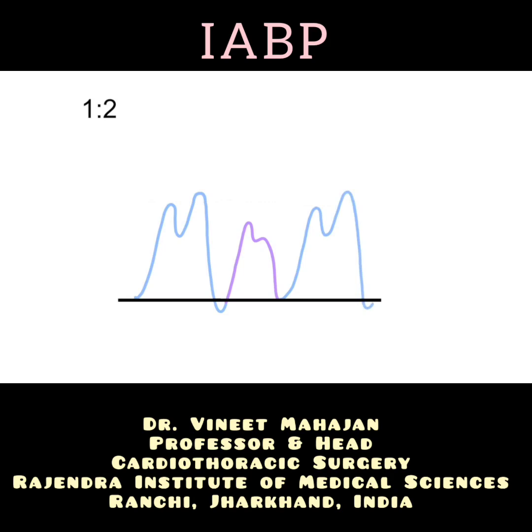Let's analyze. Here we have systole that has not been assisted by the balloon pump. We call this the unassisted systole. With balloon pump inflation, we now see the augmented diastolic pressure because the balloon inflation has augmented the pressure back toward the coronary arteries. As the balloon deflates, the pressure drops below the baseline, signifying the drop in afterload. This is called the assisted end diastolic pressure.